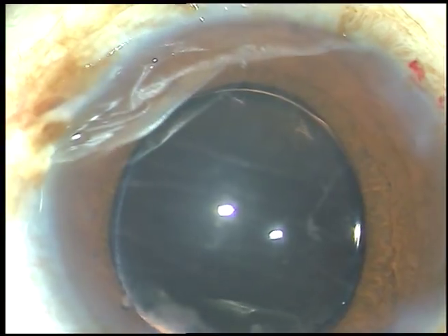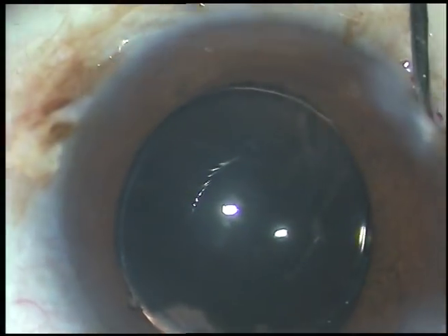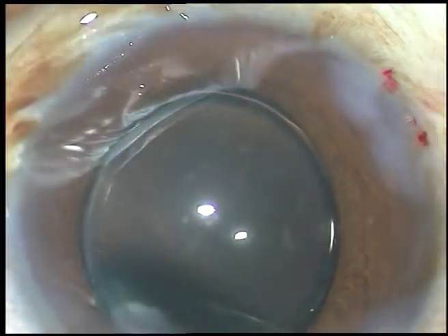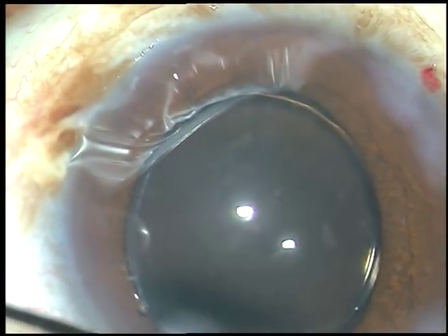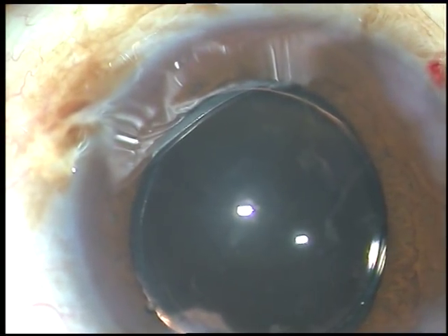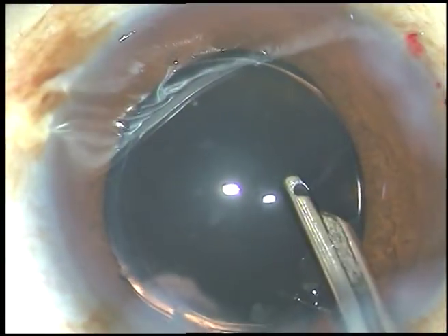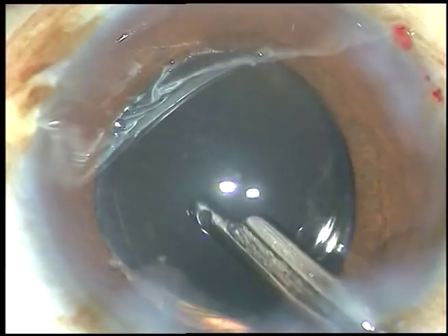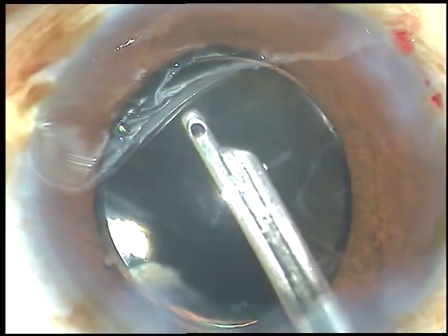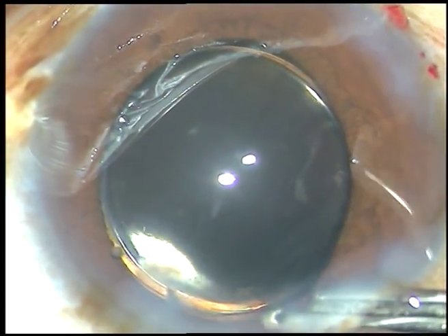We are almost through. The side ports are hydrated so that these wounds become waterproof. The anterior chamber is lavished and formed, and the case is concluded. Hope this video will help you in developing your surgical skills and encourage you to take on hard cataracts. Thank you very much for watching.